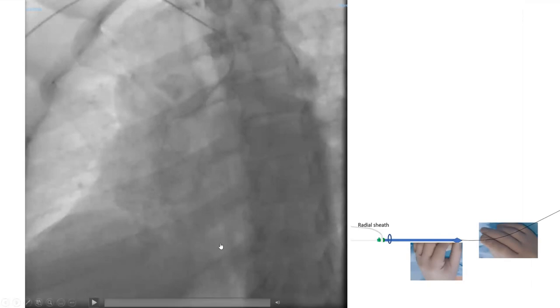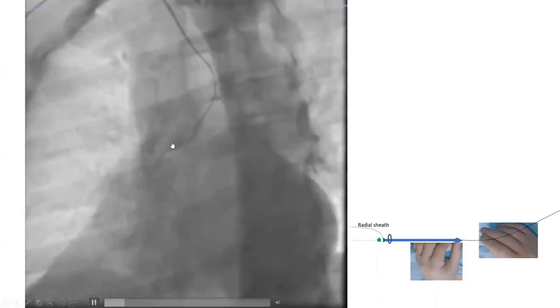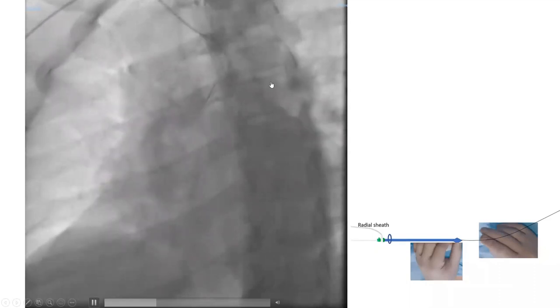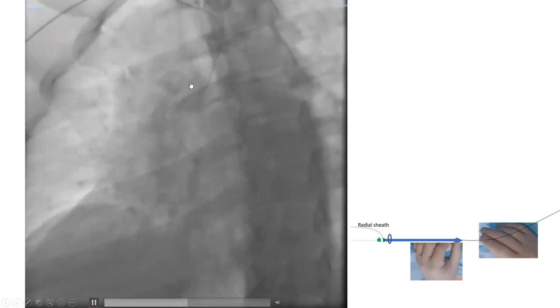Here's another case with a very difficult angle from the innominate all the way into the ascending aorta — more difficult than the cases shown before. We're trying to advance the catheter using torquing as well as deep breath and it's not working — everything is flying as we try to push. When this happens, you re-advance the wire while pulling the catheter and try again. You really try to time catheter advancement and torque to the actual point of deep breath when the chest is elongated the most — it's about timing it properly.